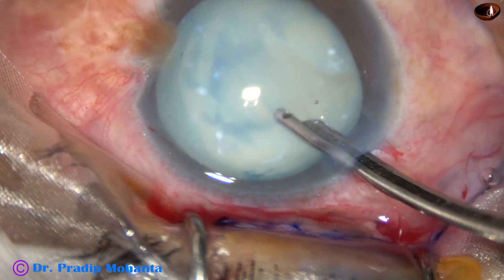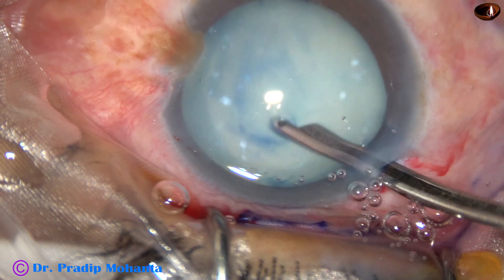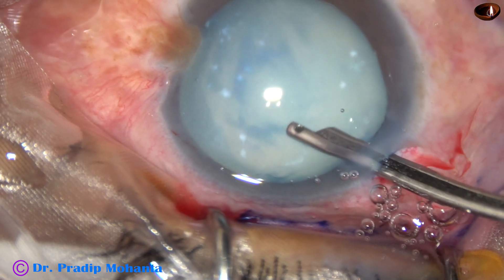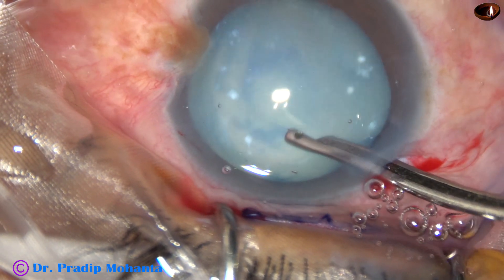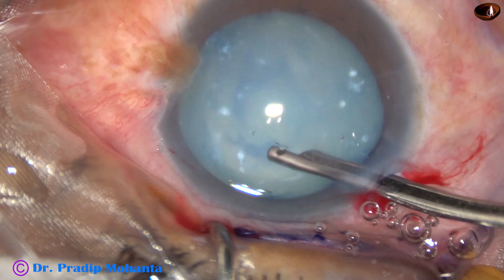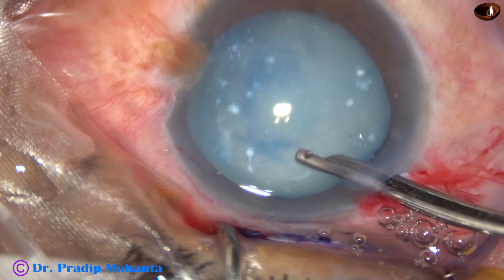Milky fluid comes out. I use a Simcoe cannula to aspirate this milky fluid. After aspirating this milky fluid — in this case, the cortex and epinucleus have been totally degenerated into a milky fluid.